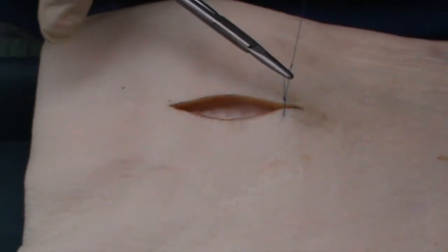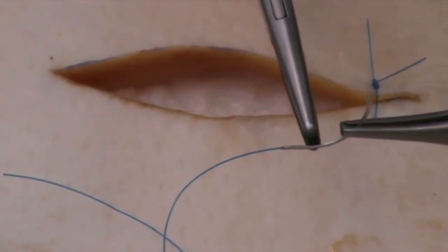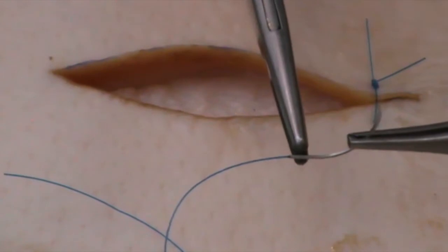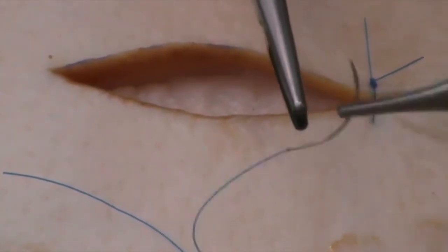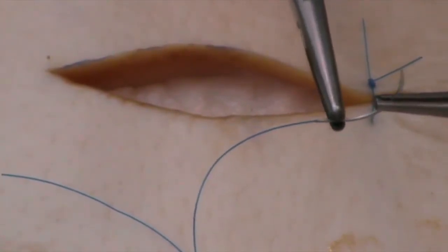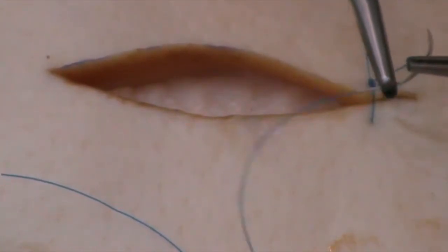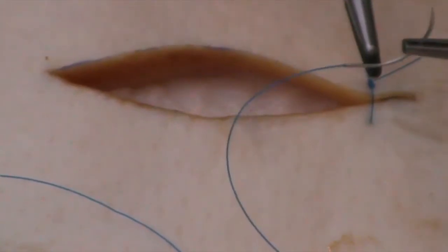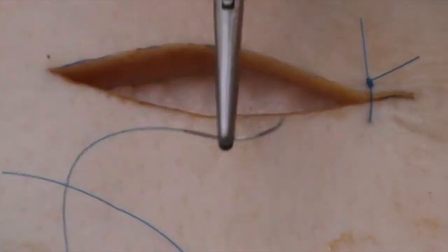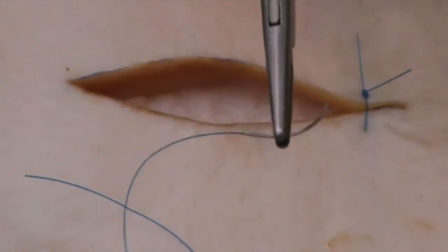You now have a perfectly tied first suture. One of the most important things in applying the needle holder to the needle is to ensure that you apply it in the correct location. This section of the curved needle is hollow — it's where the suture is attached. If you attach your needle holder anywhere along here, you're almost guaranteed to bend the needle. The maximum you should ever do is at the very base of that area, about there. Note that it's applied at 90 degrees to the needle holder and at the very tip of the needle holder — that way you're not crushing it.